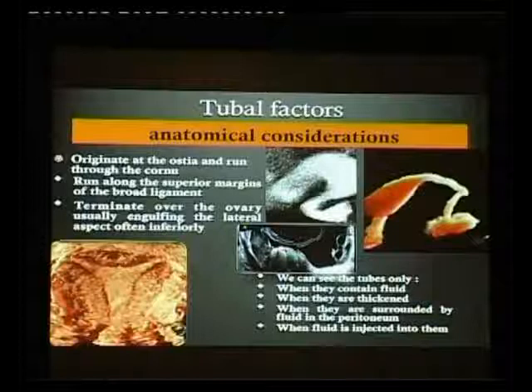This is important because it is a non-invasive procedure in which we can calculate the exact amount of pus in the dilated tube, and the clinician might want to put the patient on anti-tuberculous treatment or antibiotics. After a course, the patient may come back again and we may calculate the amount of fluid. If the fluid is getting reduced, then we know the progress of the patient.